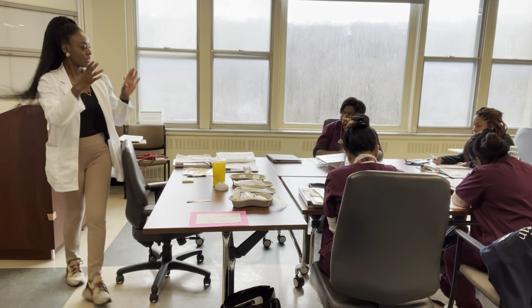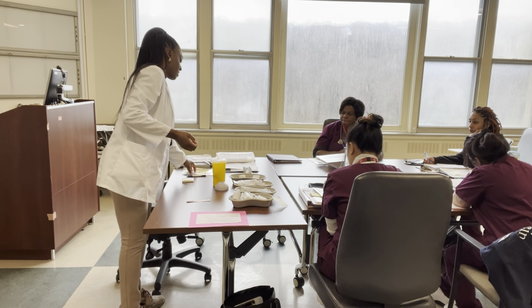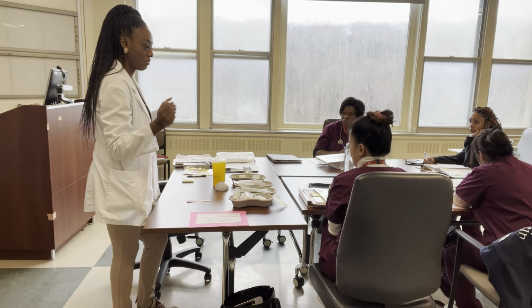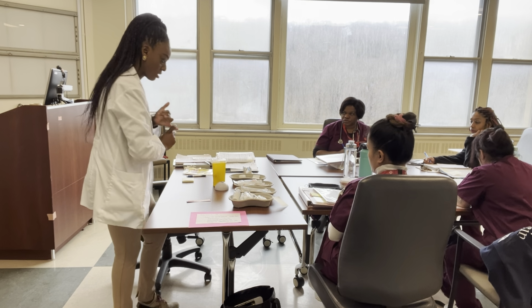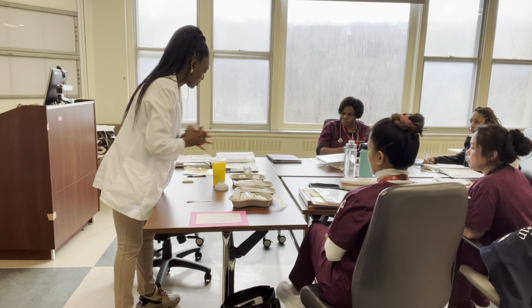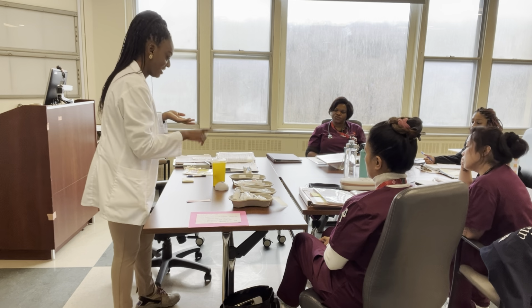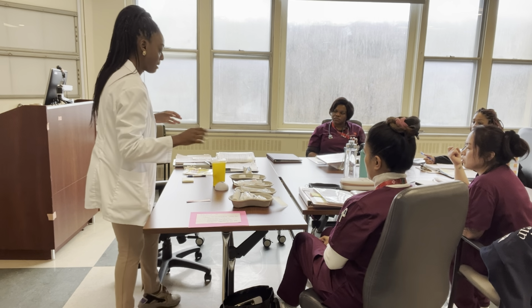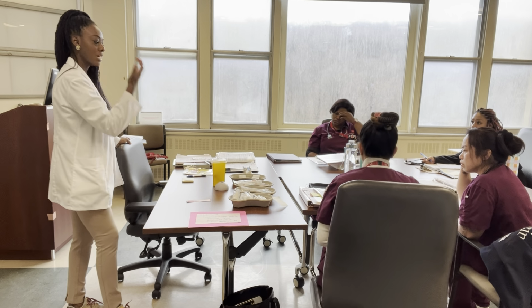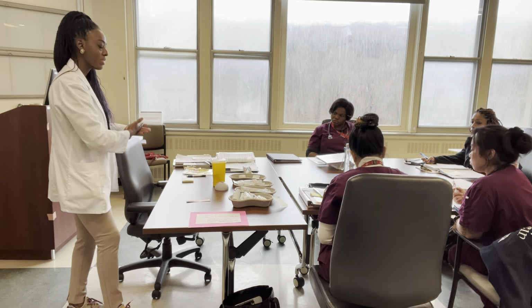Now we're going to get our equipment. At this point, we need to gather all the supplies whenever we do an injection. So what do you think we need? Off the top of your heads, do you know what you need? Injection. Okay, what does that mean? Syringe. Right, we're going to pick the right syringe. What else do you need? The alcohol swab. Okay, perfect. So you have an idea. Always write it on a list so when you're implementing it, you have all the supplies gathered before you call me, so that we can from there go into the patient's room.